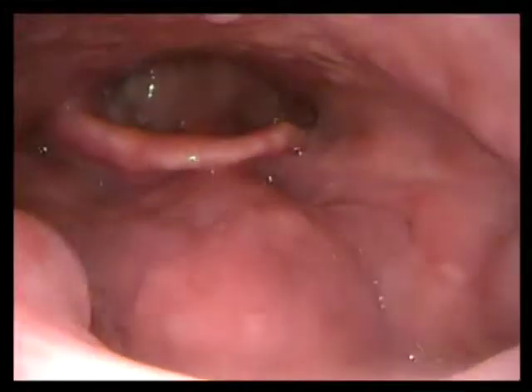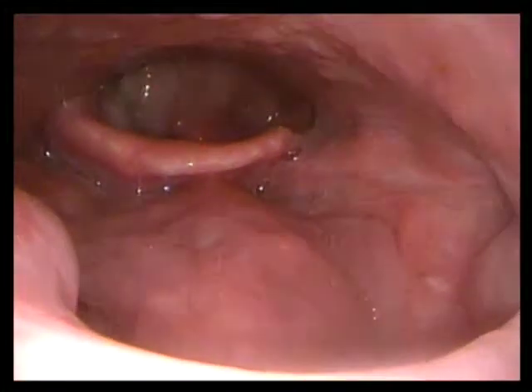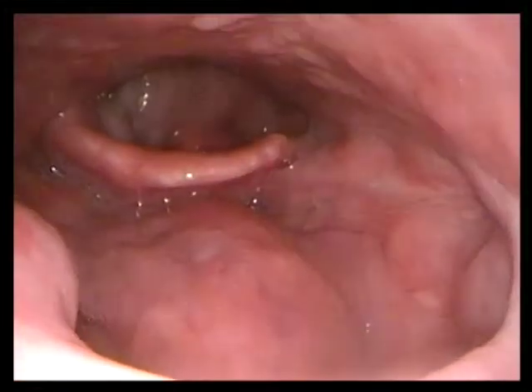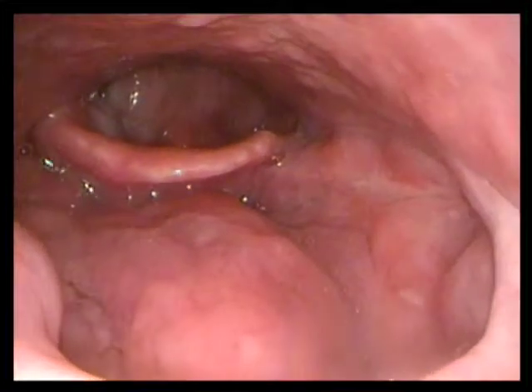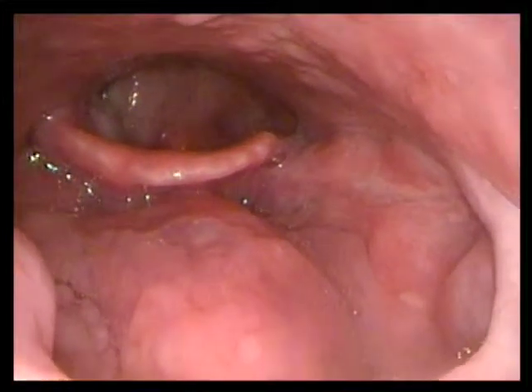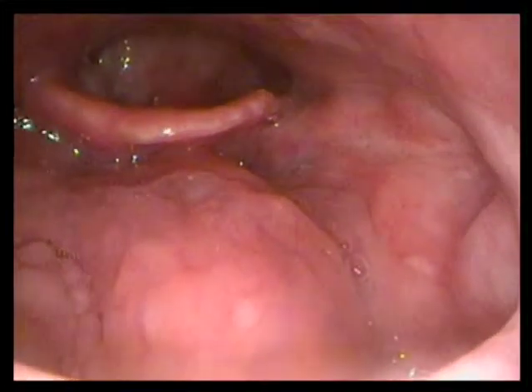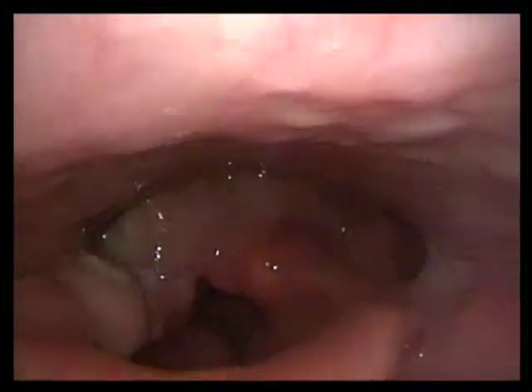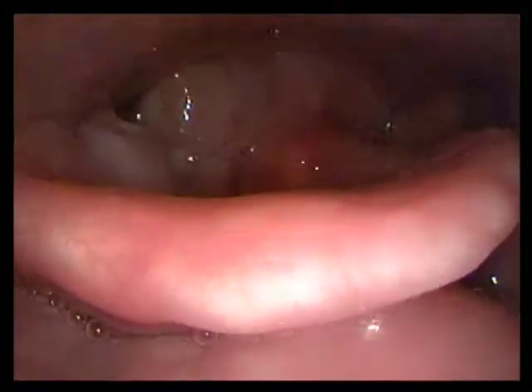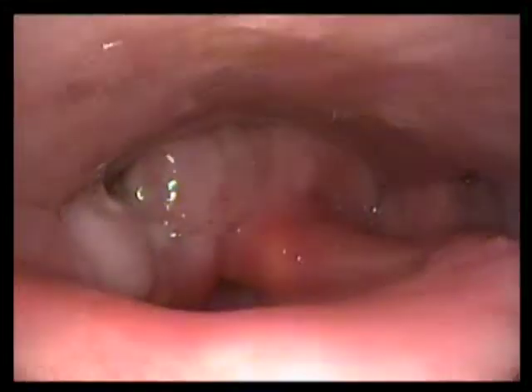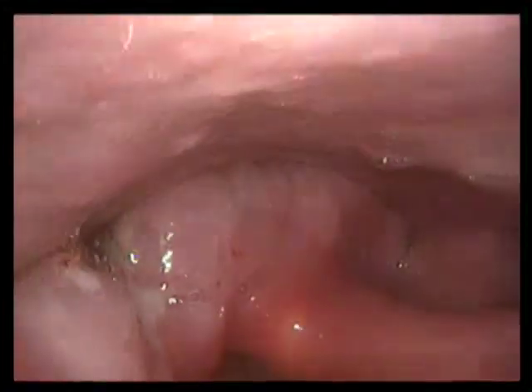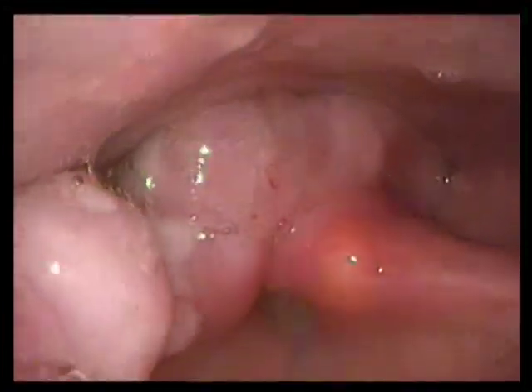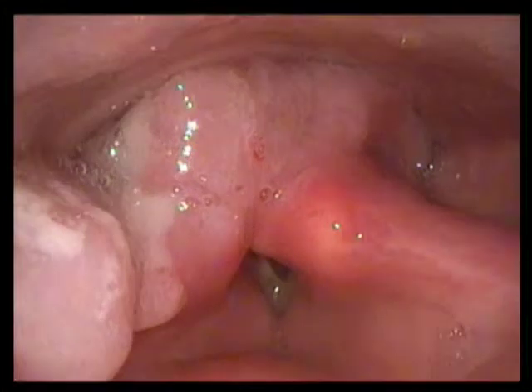Preoperative endoscopic airway evaluation is used to evaluate the airway fully prior to bringing the patient to the operating room for an anesthetic. It is often used to decide whether or not the patient requires an awake intubation.